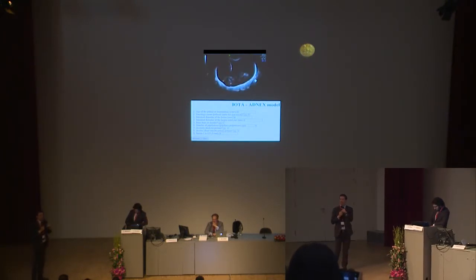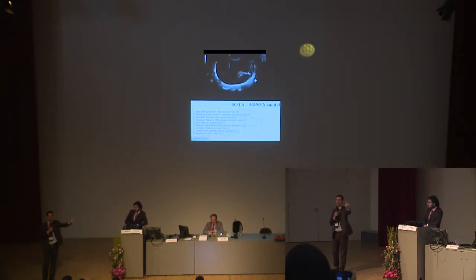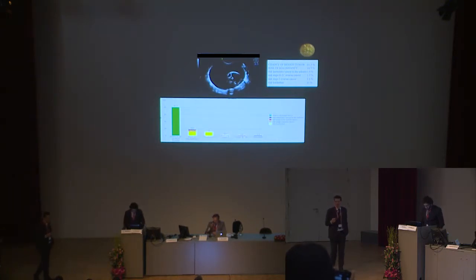But we will see in the room: can this half of the room calculate it with shadows and that half without shadows? And then we will see the outcome, whether it makes a difference. Without shadows, it tells almost 20% risk of being malignant. And if we assume that the cutoff level for defining a given mass malignant is 10%, you would say yes, consider this as malignant. If you would say shadows, yes, it's only a 1.9% risk of a borderline tumor, and the mass is classified as benign.